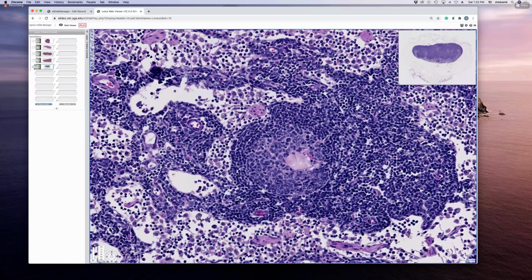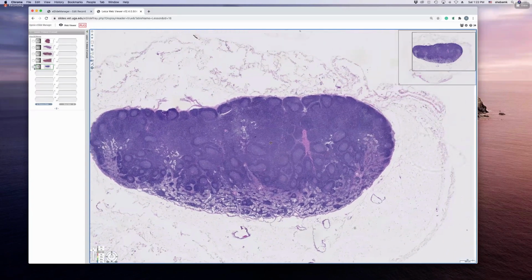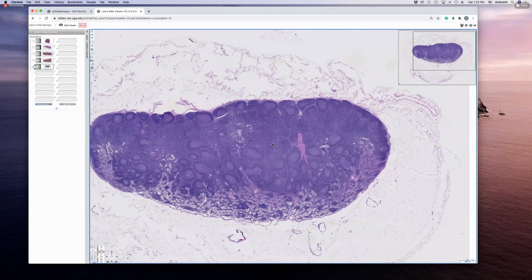What are these cells that contain these brown cytoplasmic inclusions? Who are they? These guys. Macrophages. Okay, so these are all macrophages that are also here in the lymph node. Okay, so if we zoom out a little bit, let's zoom out. There are two types of lymphatic nodules. Okay, so what are they? Primary and secondary. Yes.